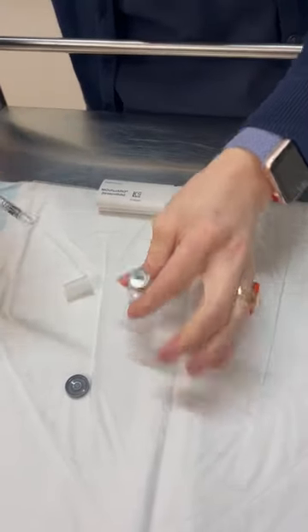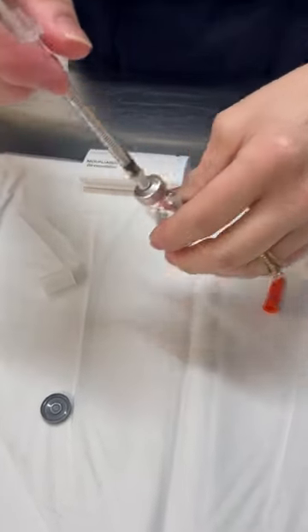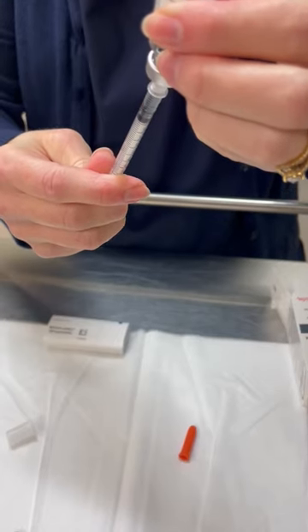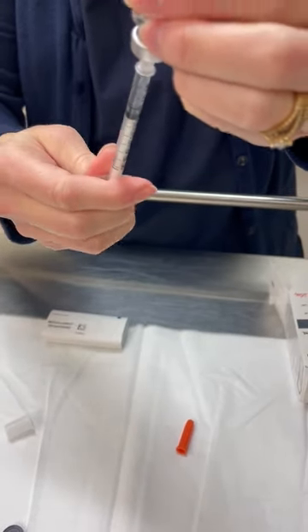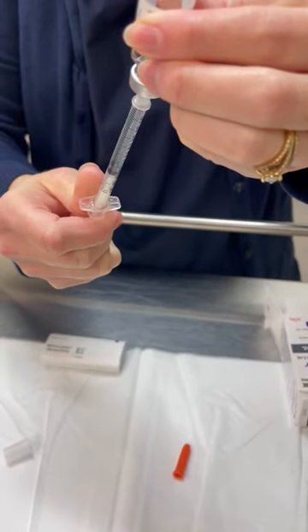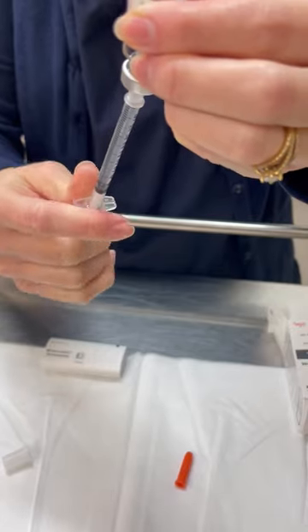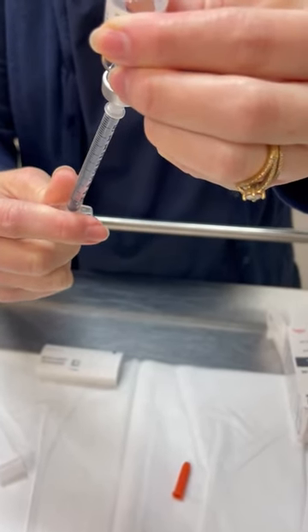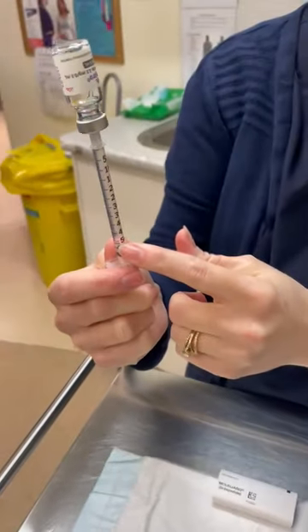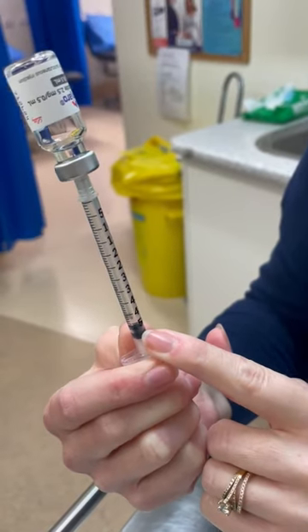They are very little needles, so you pop it in just like so, flip it upside down, and then you want to slowly draw up the whole thing. She said sometimes there's more in it than required, so she said just take how much you need — which is basically the point five mark, you want the line to be on there.